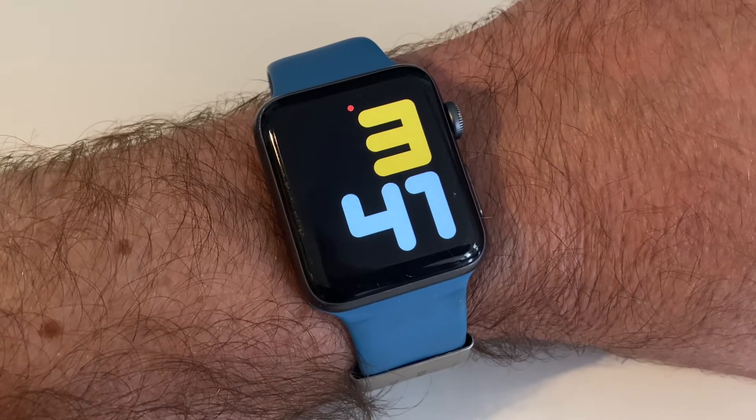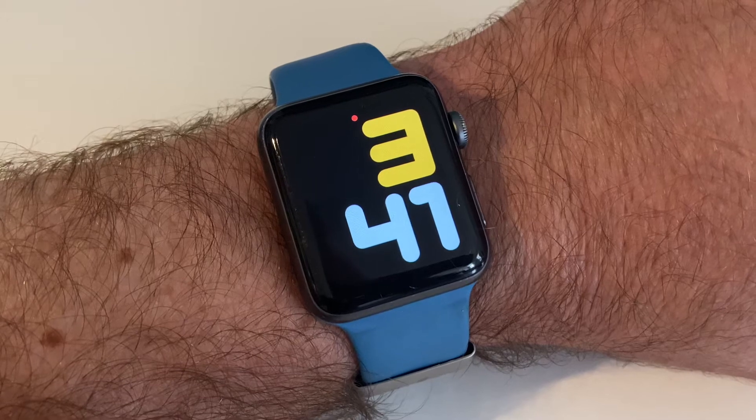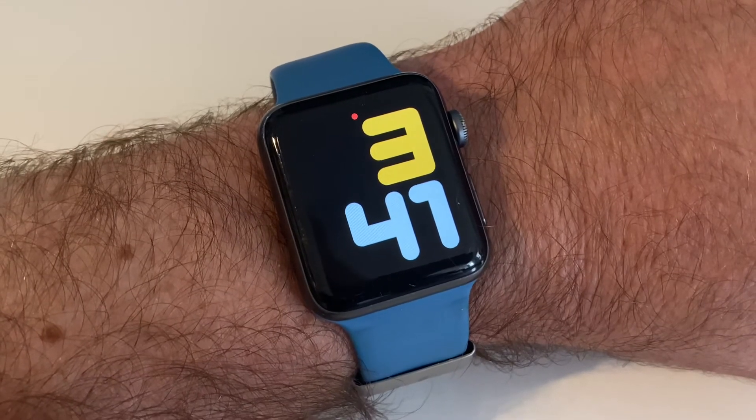Hey guys, Geeky Diabetic here, just showing you very quickly what you can do with Night Scout, your CGM, and your Apple Watch.